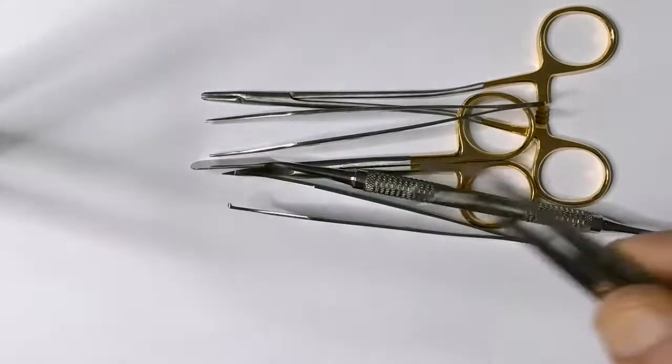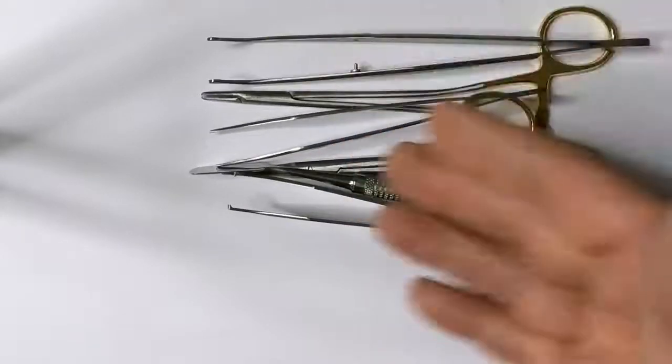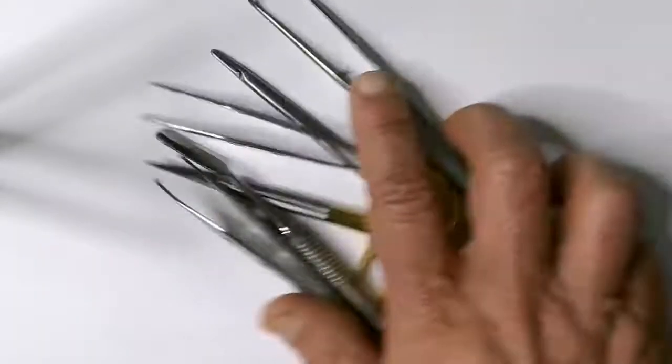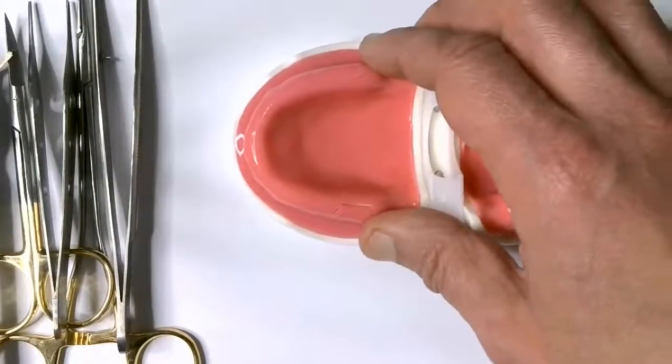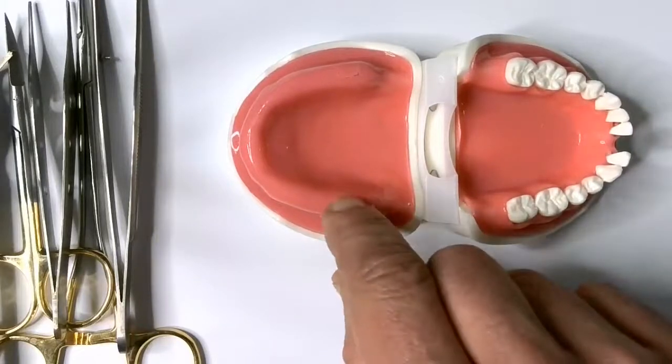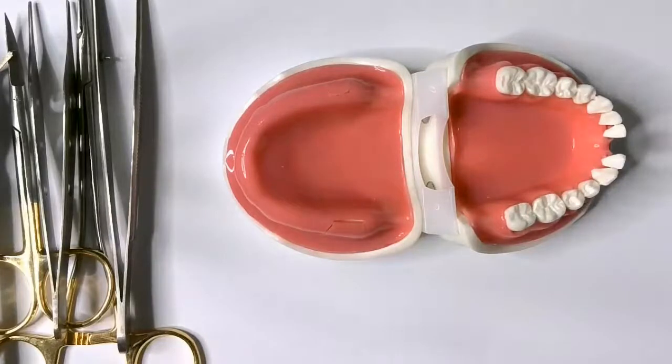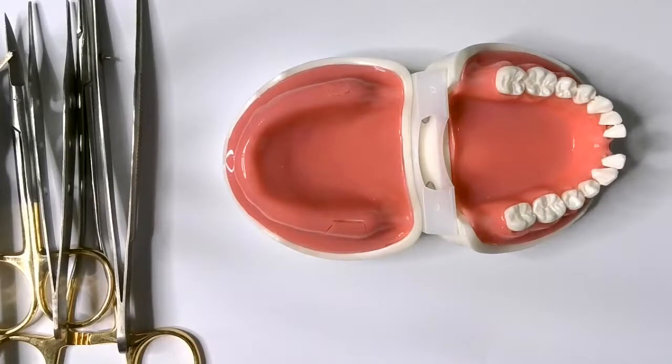Okay, so these are the instruments that are essential for starting suturing. Now we'll get these out of the way and get the suture model and have a look at what we can do here. Now I've cut a flap here, just a little one, just to explain or demonstrate how suturing is done easily.